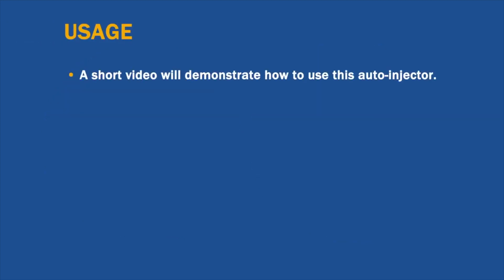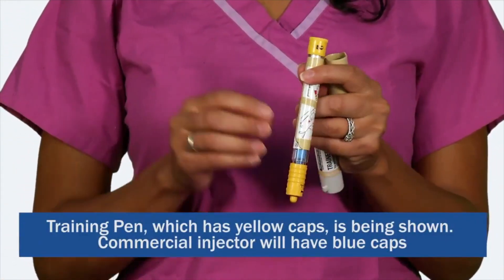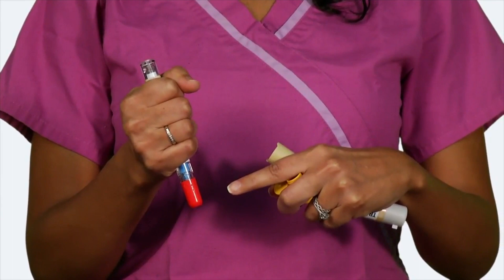Remove the Epinephrine Injection USP Auto-Injector from the protective case. Twist and pull apart the protective case to reveal the auto-injector. Remove both blue end caps. You will see a red tip — this is where the needle comes out.